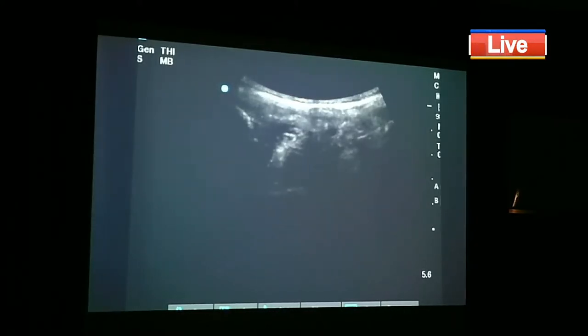Only I want to mark this, and then I want to just draw a line there. So why center of the probe? Because first I will make it the center of this screen, then I have a marker here in the center of my screen. So run the pen along with it a little bit, so you will be clear what mark is this, and where you are doing all this.